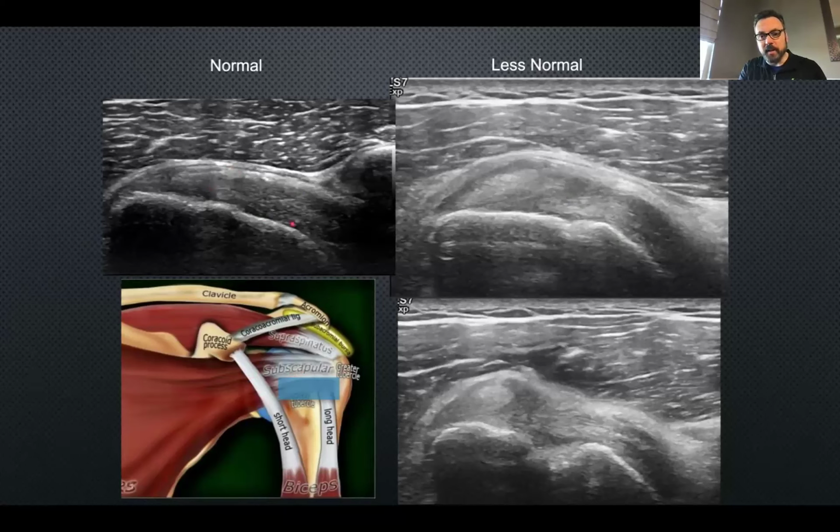In our particular patient, we do not see the entire subscap. And then we have this oval lesion sitting right here. Well, this is normal anatomy. It's just sitting in the wrong spot. Instead of being here in the bicipital groove, it has bounced medially. What we have is a dislocated biceps tendon. So this was sent back to the surgeon, and the surgeon ordered the MRI because that's what they're comfortable with.